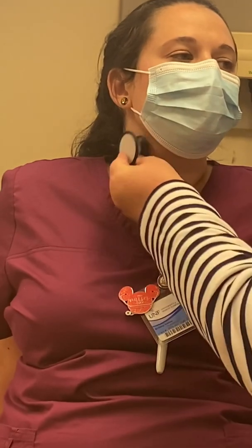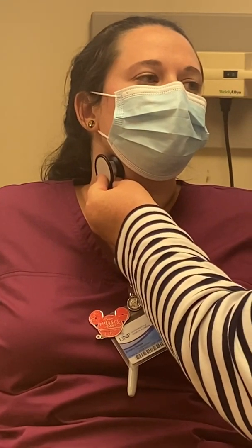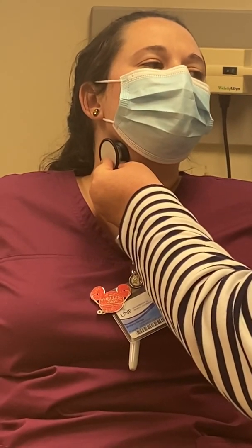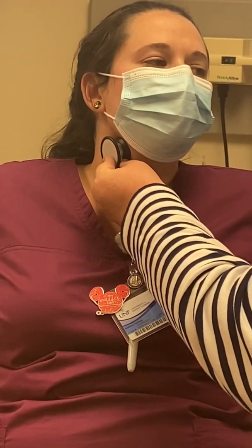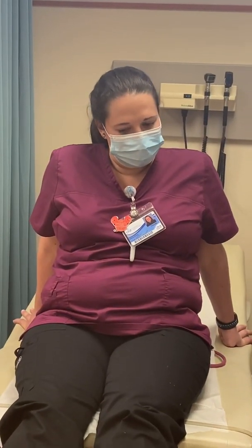Here it is. And a good idea is to hold your breath, Brittany, to increase the blood flow. And now let it out. And you'll hear a lot of backflow after that. And so it was fine. We did not auscultate a bruit, which is excellent.